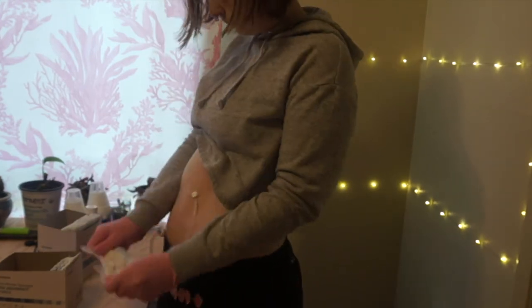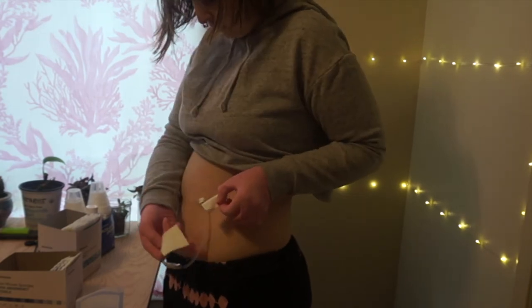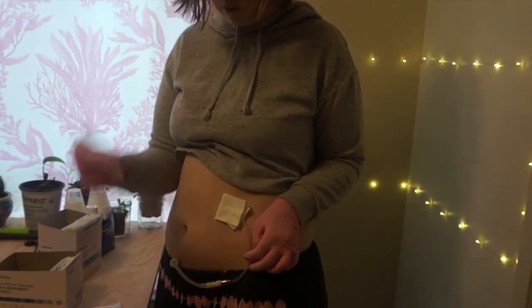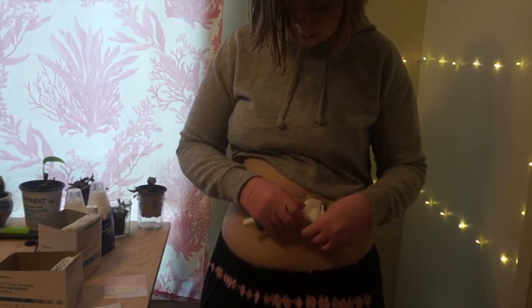I used two halves of a piece of gauze to snuggle around the exit site and the catheter, and then coiled the catheter into a circle and completely covered it with the large 3M Metapore bandage so that only the end of the transfer set sticks out to do exchanges.